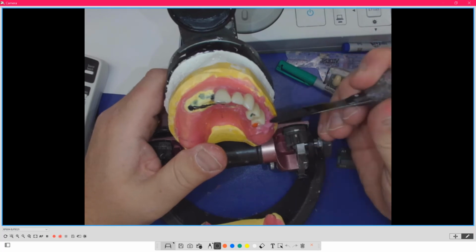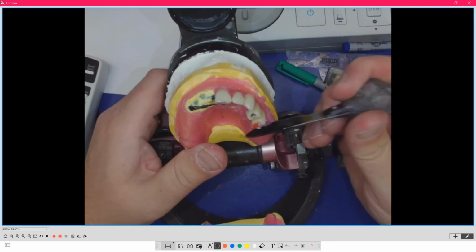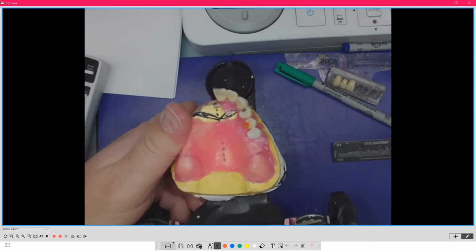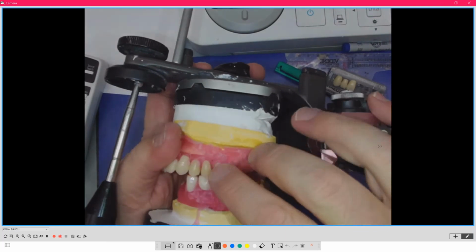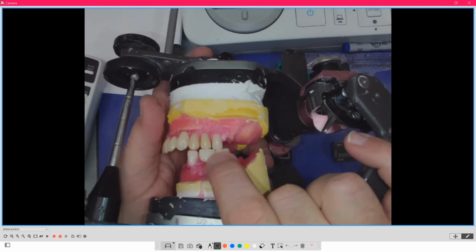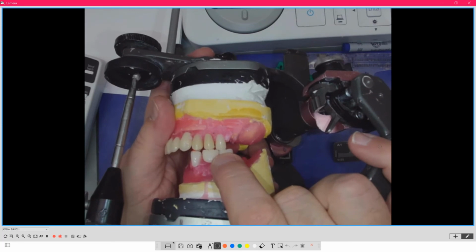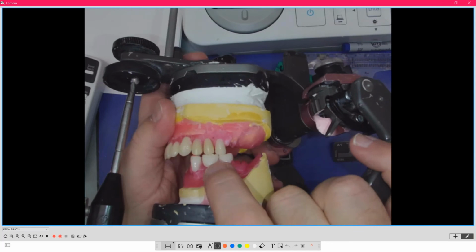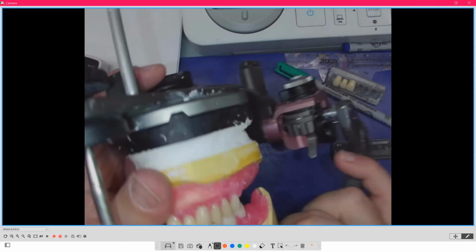So we can, again, show you the what if. So let's put in another one. So now I've done another second premolar, had it come in. Look, it just nestles right into the fossa. That's the beauty of these teeth. I honestly don't care what cusp you put in what fossa, because it works.